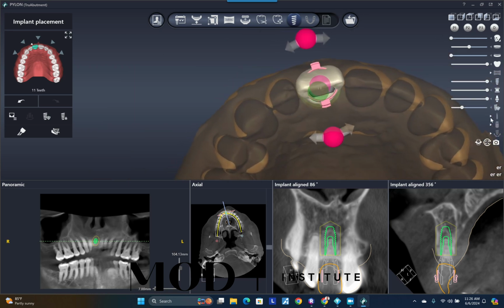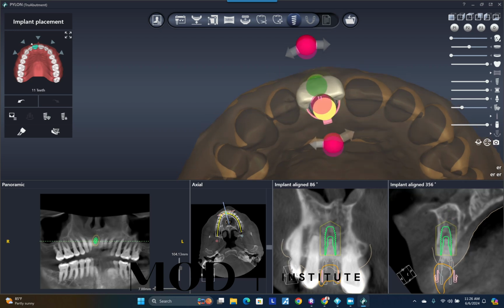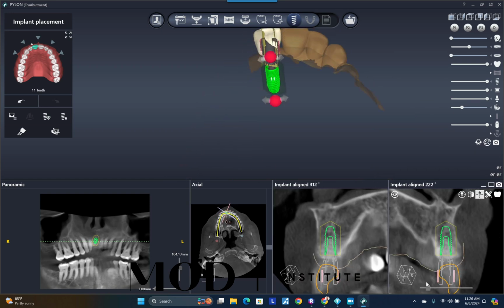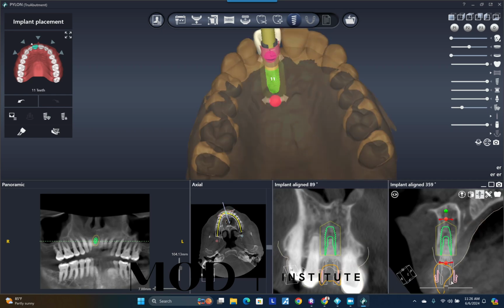It is a phenomenal implant with a deep internal conical connection with Morse taper. It has SLA surface with a huge platform shift, so I'm comfortable placing it subcrestal. And the nice thing about that system, I think, is that the guided kit is pretty powerful and easy to use. Their PYLON kit, which is all keyless, it uses pylons.